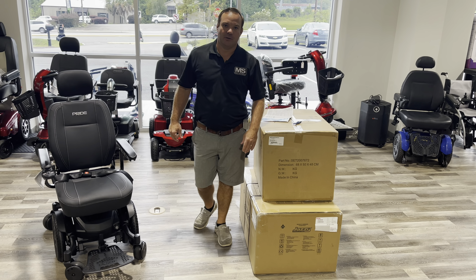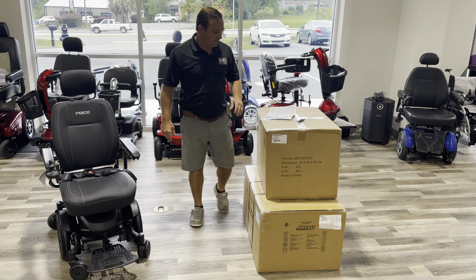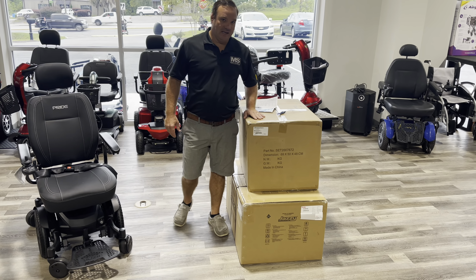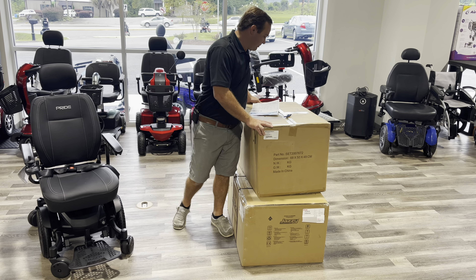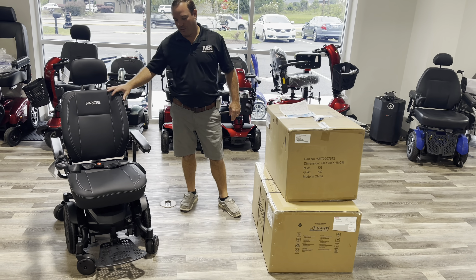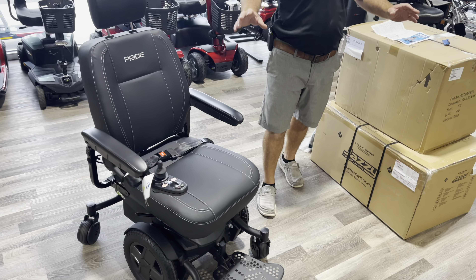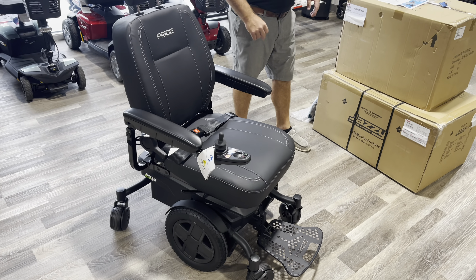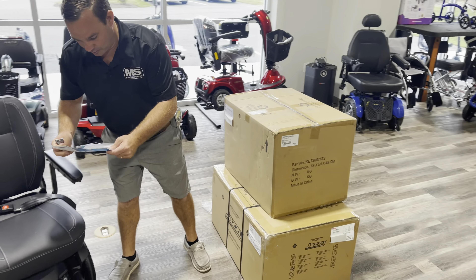Hey, I'm Chris with Mobility Solutions, AffordableMedicalUSA.com. Today we're going to do the unboxing video of the brand-new Evo model 613 with the standard batteries, the AGM batteries. Right beside me is the Evo with the lithium batteries. Same chair, two different batteries. We'll explain the difference and there's a difference in weights.